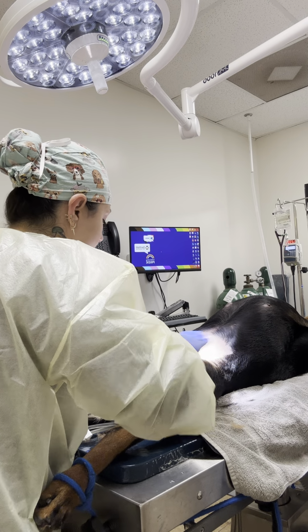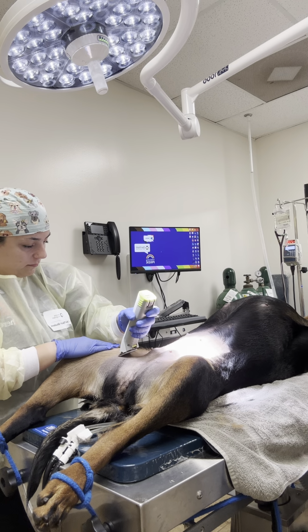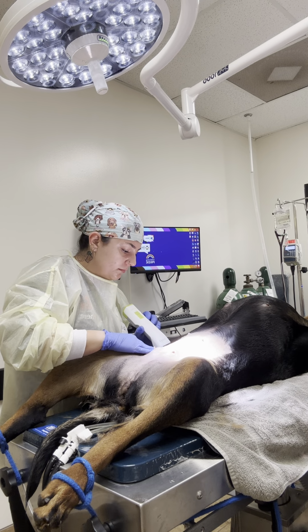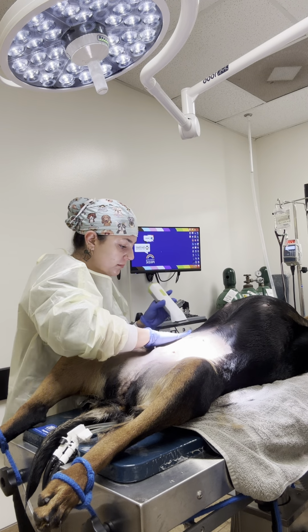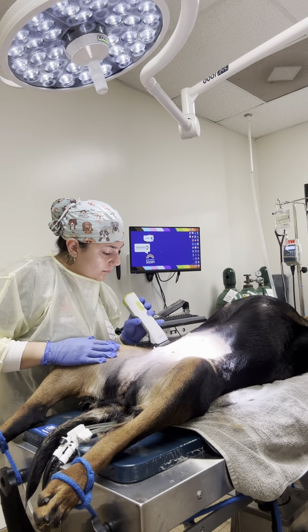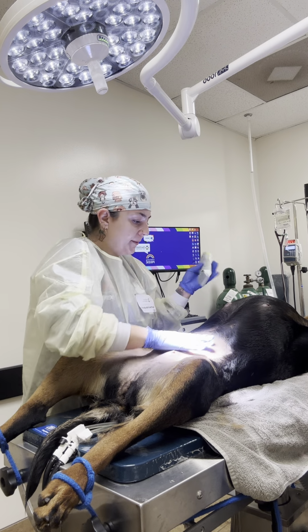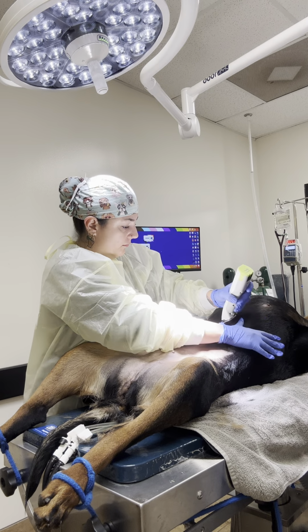We just had a block here. A what? AV block, right? Where? There's no QRS complex following it. Okay. So AV block would also be considered an indication of glyco. So if we're bradycardic and starting to get AV block, then I'm going to start dripping in the glyco and trying to get our heart rate up to the 60 mainly. Okay. And then that way we can get a reasonable anesthetic plane when it starts to cut. Okay.